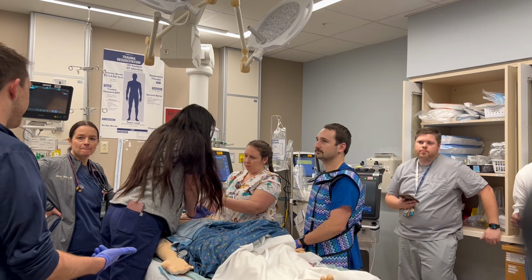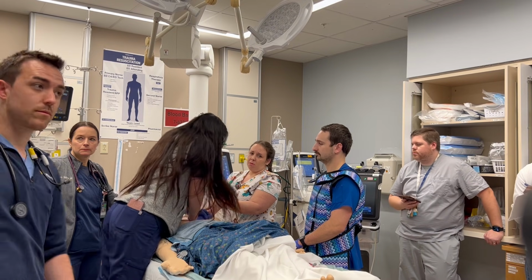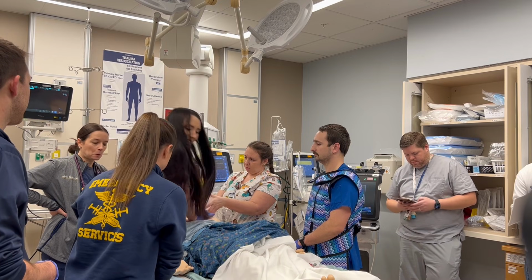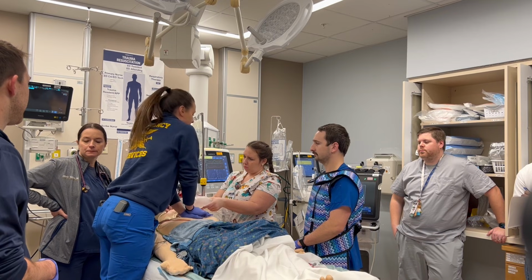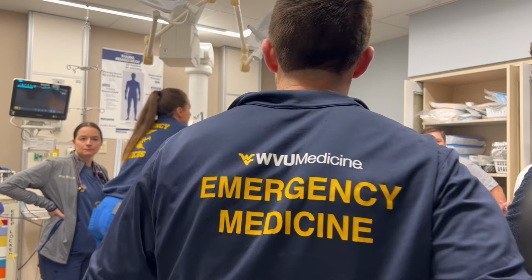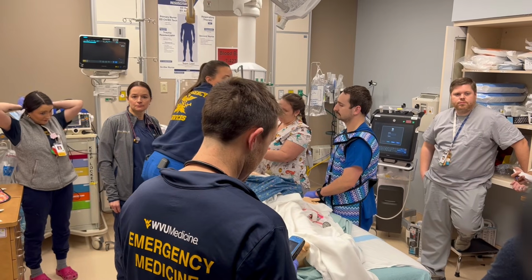Okay, so bilateral effusion, and we'll get our next dose of epi in the next 2 minutes. What are the ECMO teams going to do, are they going to call you back when they're ready for us to transport over, or what's the plan? I can call him back, he said he was activating everyone on his end, but I can call him back and make sure. It's going to take time to get out of there, so when we start rolling, we can probably do the job.